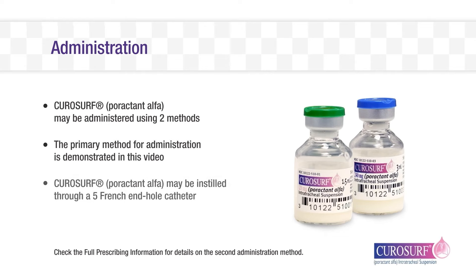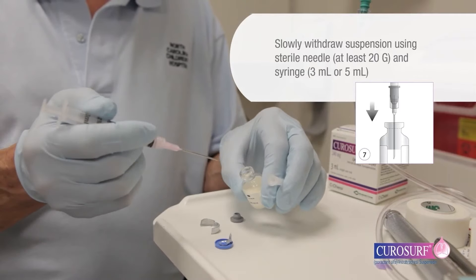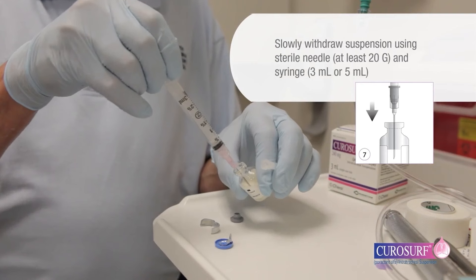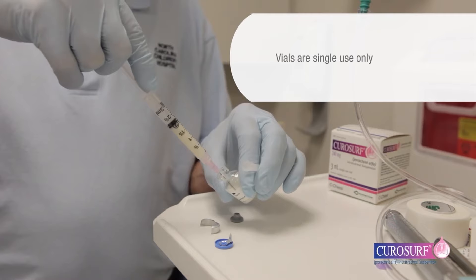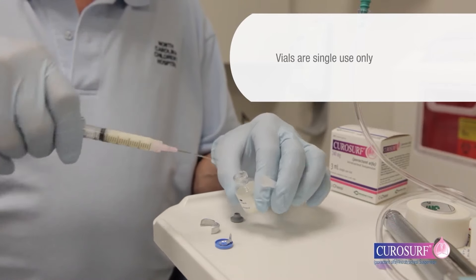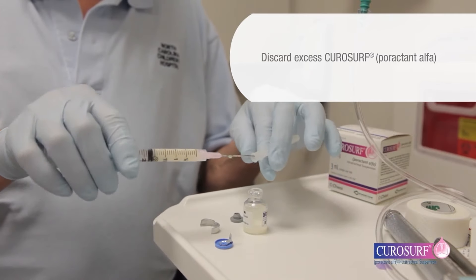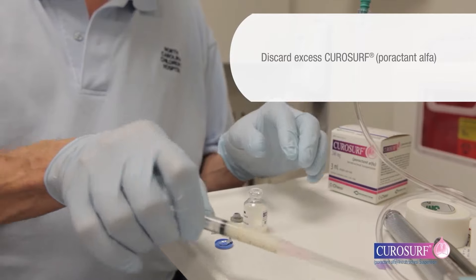CuroSurf may be instilled through a 5-French end-hole catheter. The suspension should be slowly withdrawn from the vial using a sterile needle, at least 20 gauge, and a 3 or 5 milliliter plastic syringe. Given that each vial is for single use only, it may be easiest to withdraw all content from the vial, discarding excess CuroSurf, so that only the total dose to be given remains in the syringe.